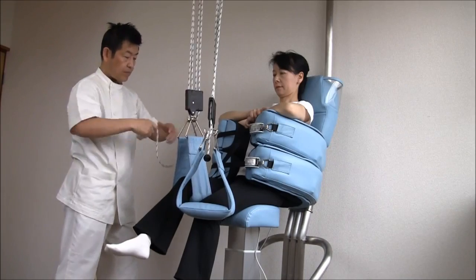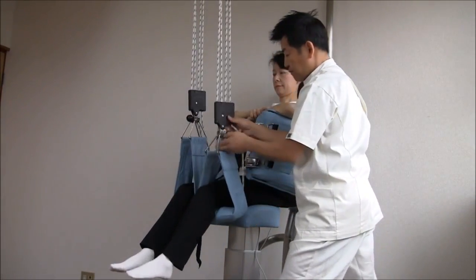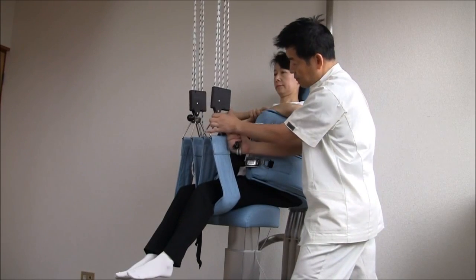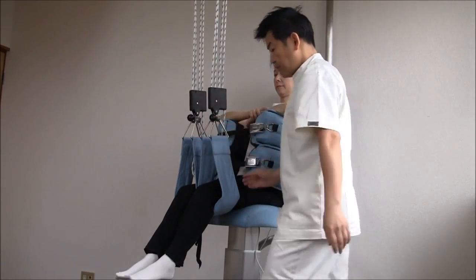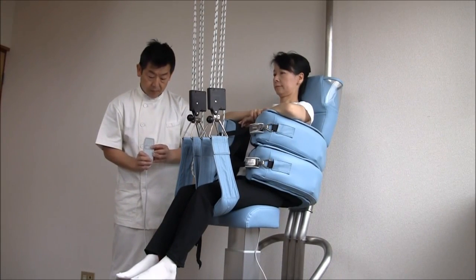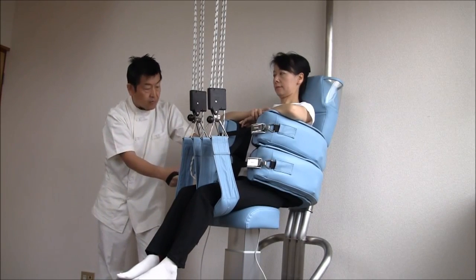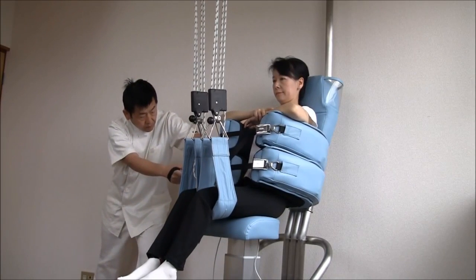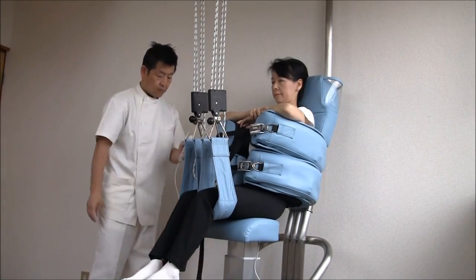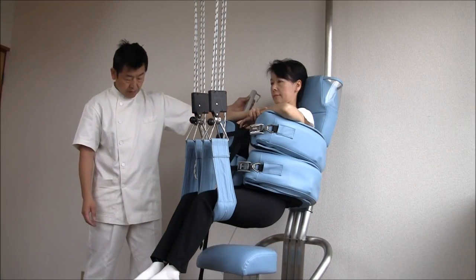Adjust the leg strap so that the femur is parallel to the ground. Now, lock the pulley unit by snapping the rope into it. Use the remote control to lower the seat and then further tighten the lower arm cushion. If the patient is feeling uncomfortable, lower the seat only so that it is just barely touching their glutes.